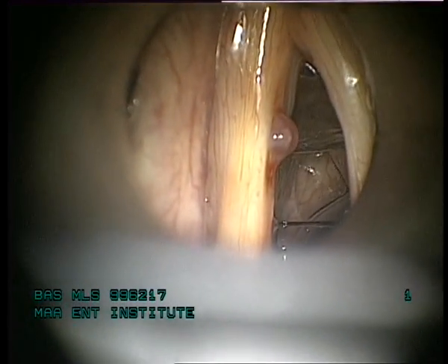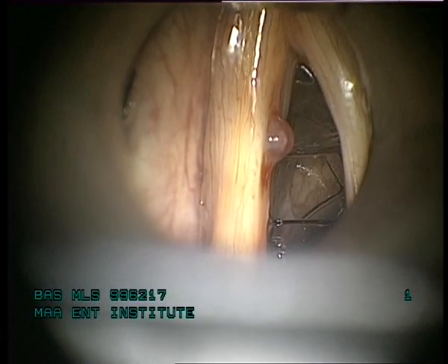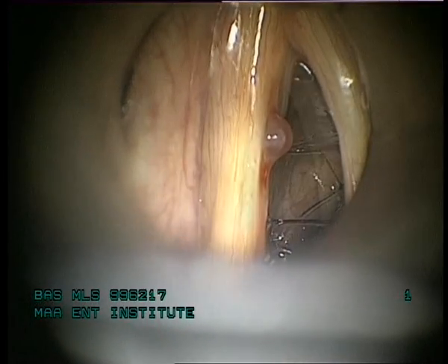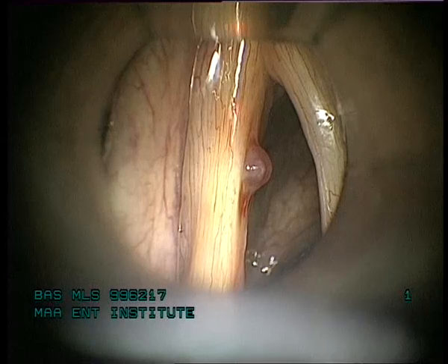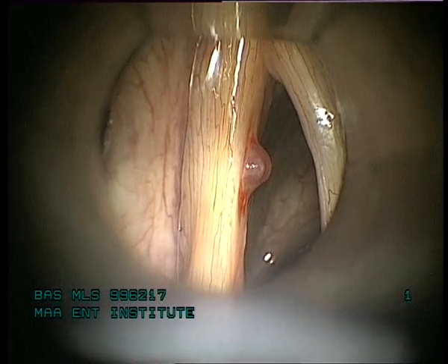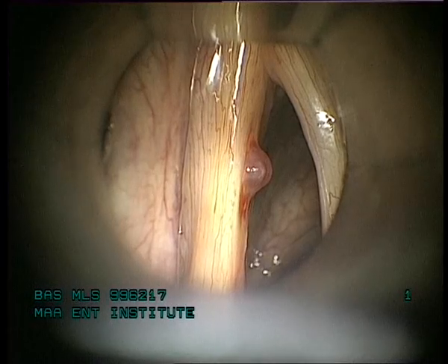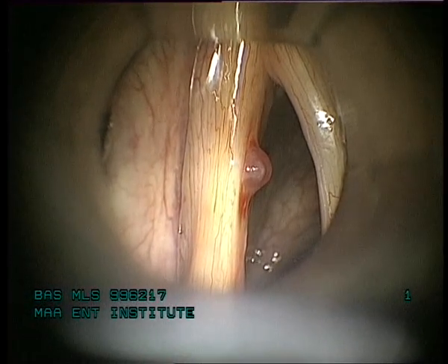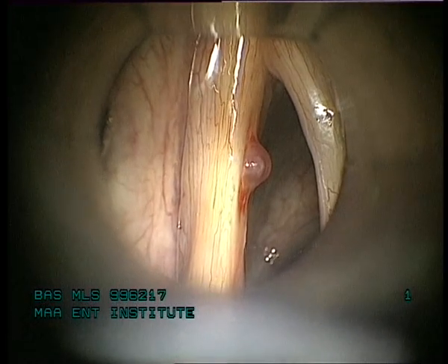Now we have the micromanipulator attached. You can see the laser beam now. The next step is to remove the endotracheal tube and protect the subglottis with a saline-soaked gauze.